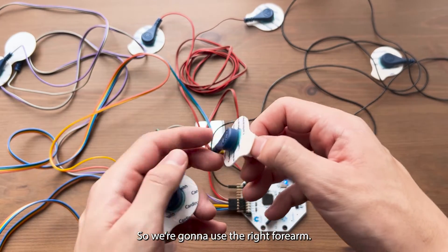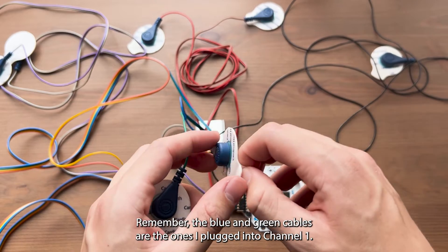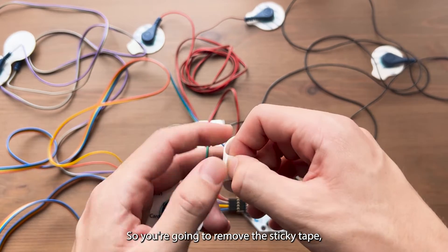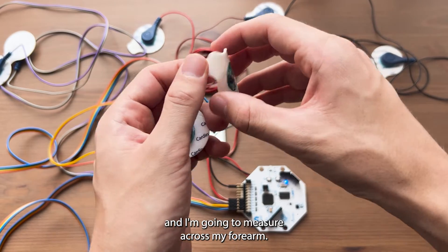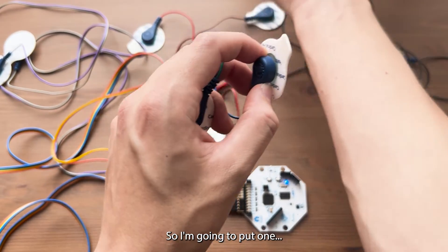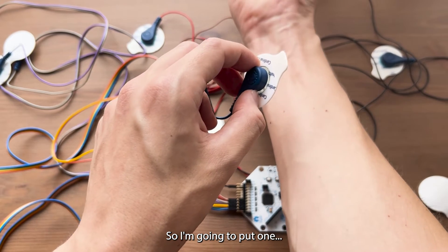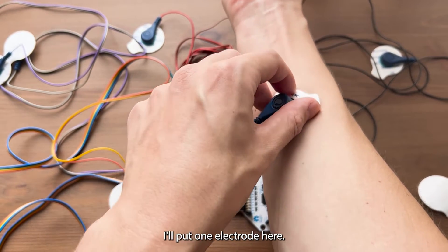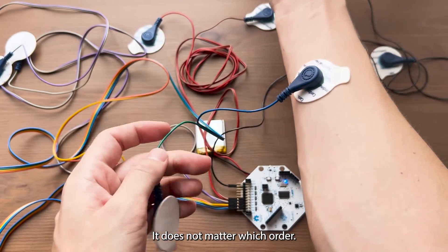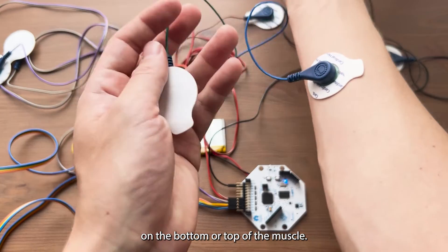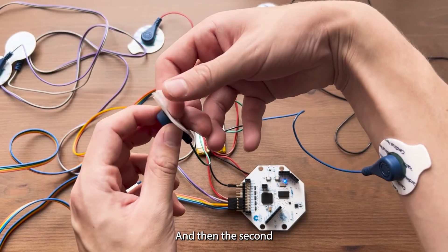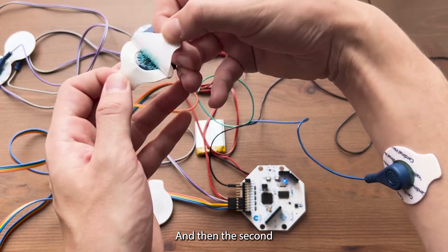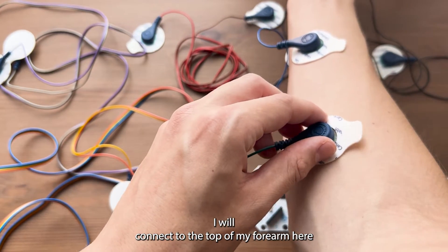I'm going to use the right forearm. Remember the blue and green cables are the ones I plugged into channel one. You're going to remove the sticky tape, and I'm going to measure across my forearm. I'm going to put one, trying to measure across the muscles, one electrode here. It does not matter which order, if you do positive or negative on the bottom or top of the muscle. And then the second, I will connect to the top of my forearm here.